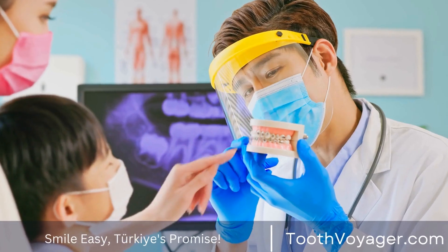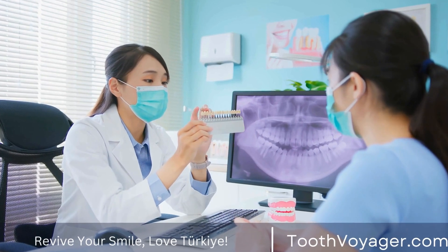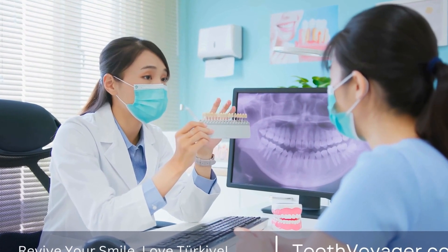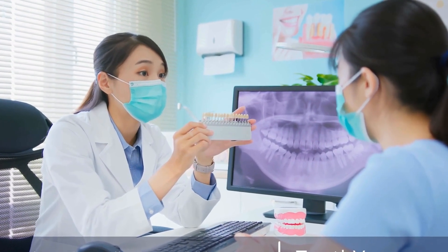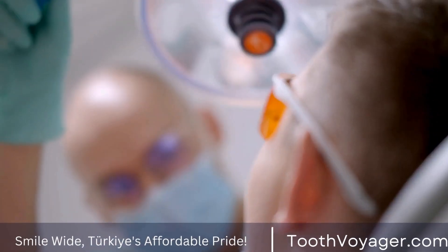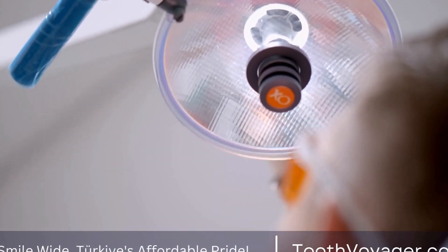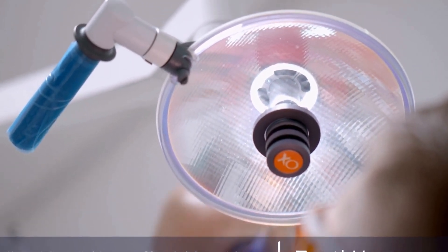Step 2: Jawbone Preparation. In some cases, the jawbone may need to be prepared before the implants can be placed. This may involve bone grafting or bone augmentation to ensure that the jawbone is strong enough to support the implants.